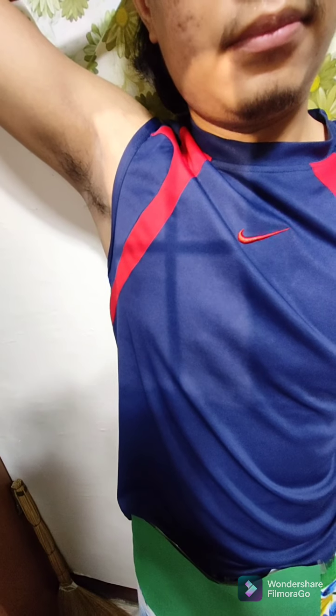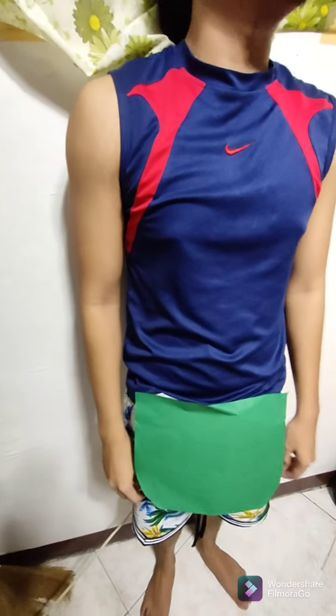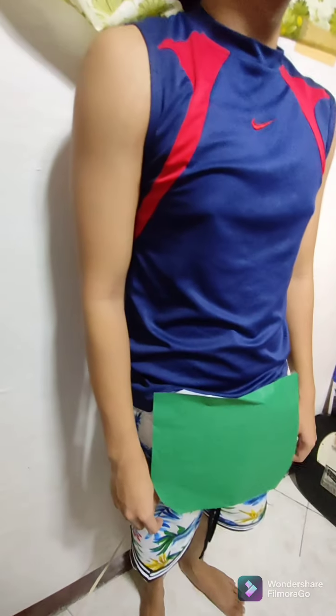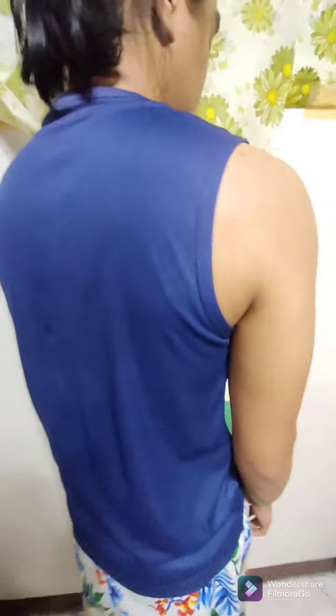So, with that being said, pwede mo na i-proceed ang pag-shoot ng beam. Then lastly is the lateral scapula. So first off, sa patient positioning, naka-erect pa rin ang patient natin. Then, to get a lateral projection of the scapula, we have to let the patient face against the IR, or in our terms is left anterior oblique position.